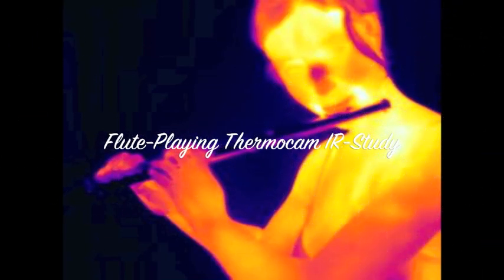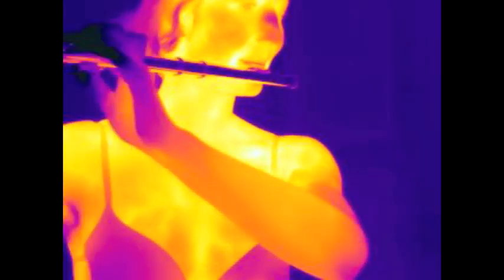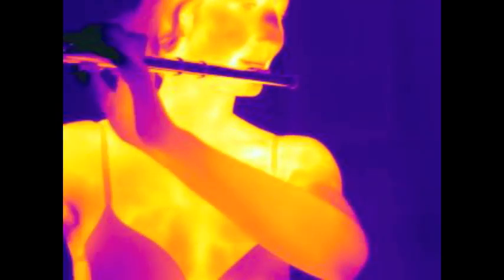Thermocam study with a female flute student by Dr. Trumpet. These thermo images after 30 minutes of playing are showing the temperature of the skin, which is correlated with the appropriate muscle activity below.